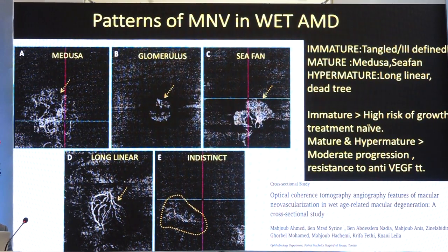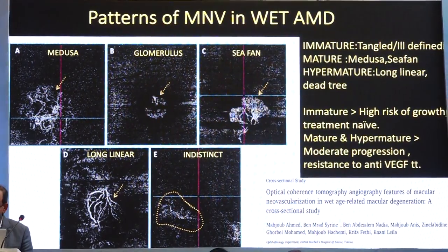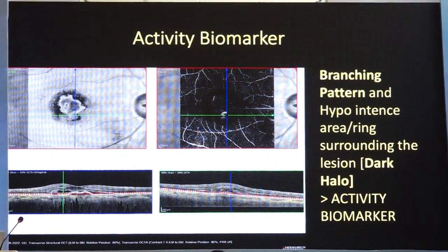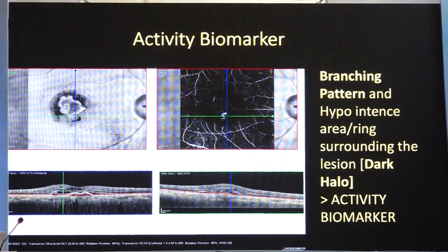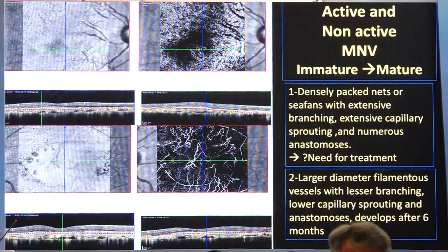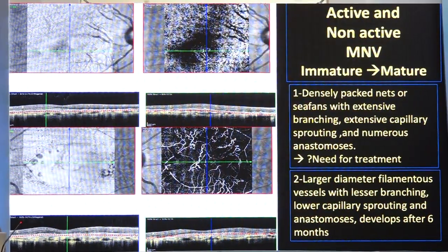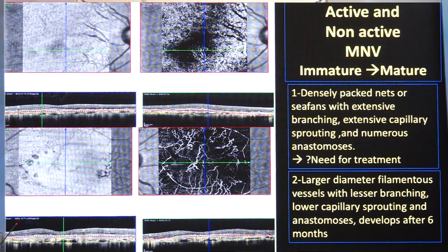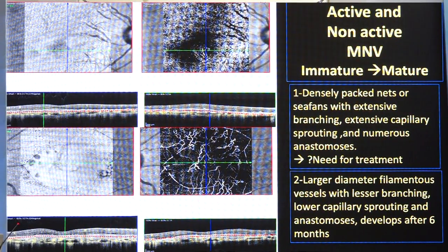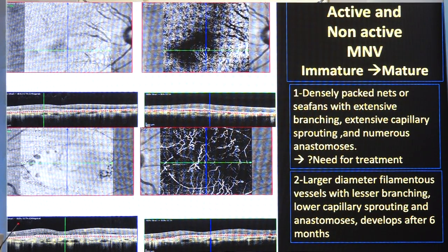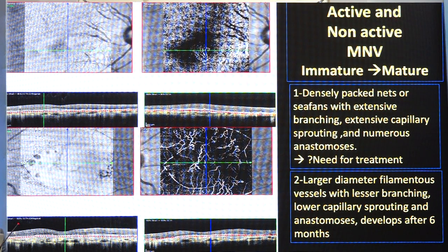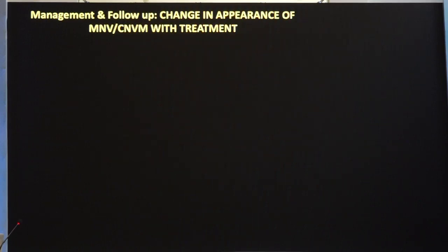Apart from the branching networks, there is a characteristic dark halo which is also an activity biomarker in these macular degeneration patients. You can differentiate between active and non-active macular neovascularization. Densely packed nets, sea fans, extensive branching, extensive capillary sprouting, and numerous anastomoses are generally the active and immature lesions — they probably need treatment. Larger diameter filamentous vessels with lesser branching, lower capillary sprouting, and anastomoses are generally mature lesions and sometimes not so responsive to treatment.